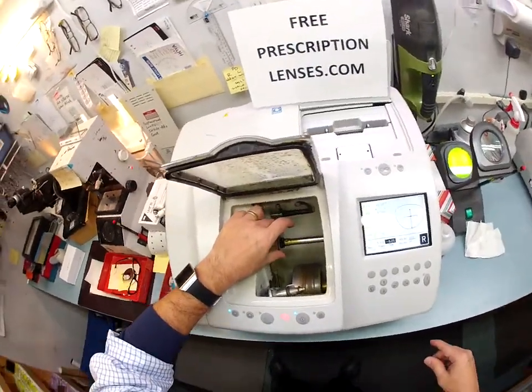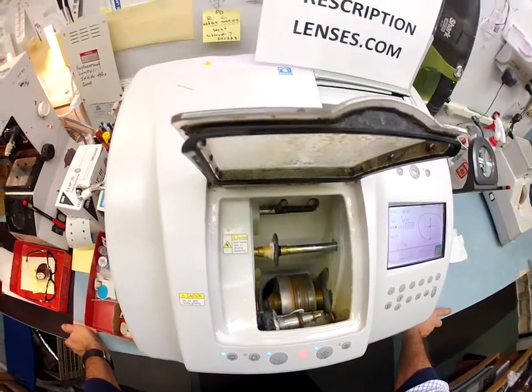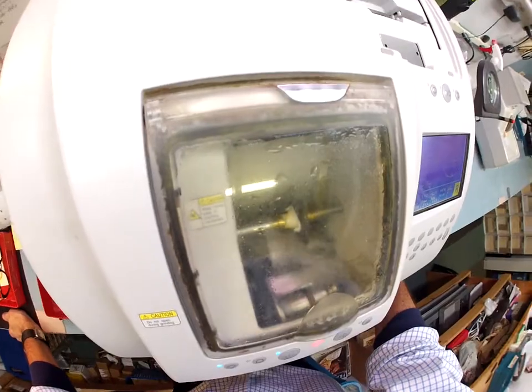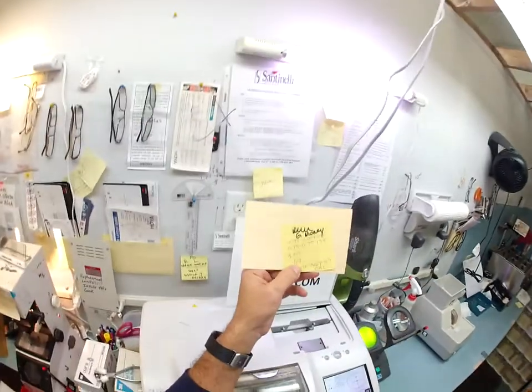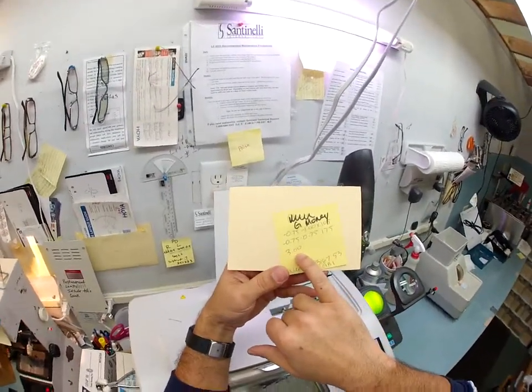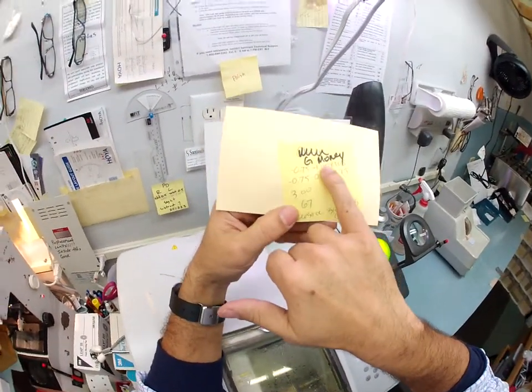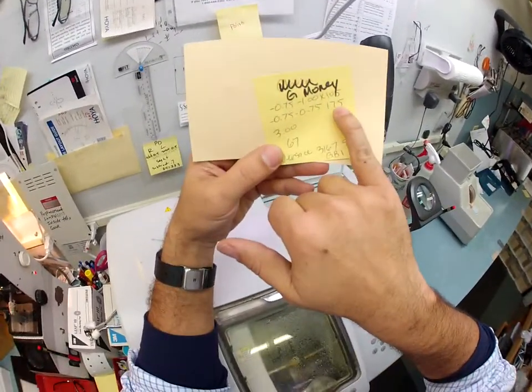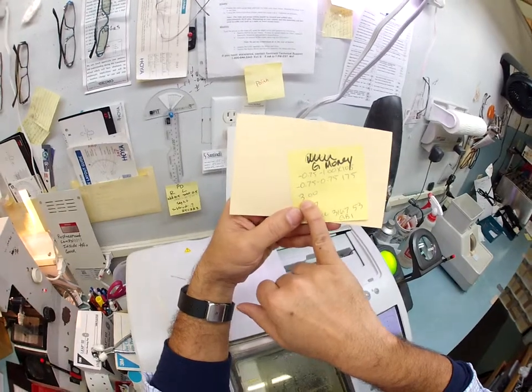Now just like before, this goes to the hand stone to grind a little more off. Your prescription — most of it is actually in the reading. Your right eye is minus 75, minus one at 105. I've blocked out your name — I'm calling you G Money for this exercise. Your left eye is minus 75, minus 75 at 175, with three diopters of additional plus for reading.